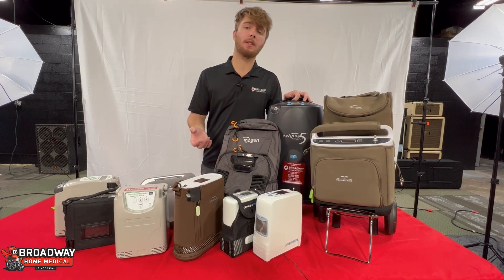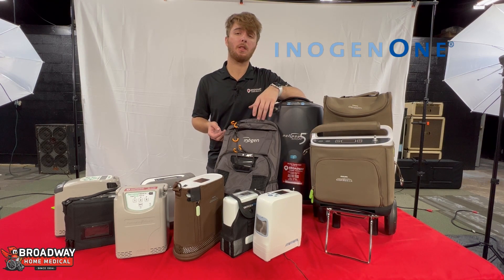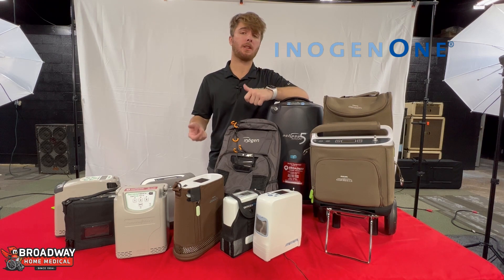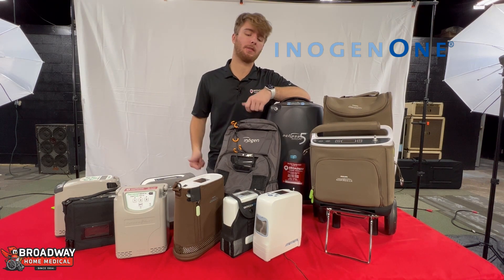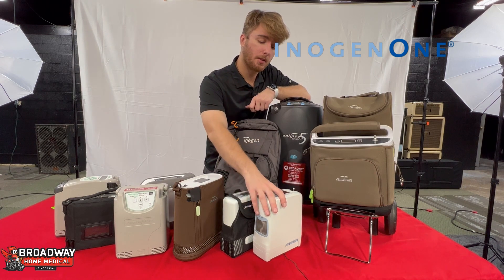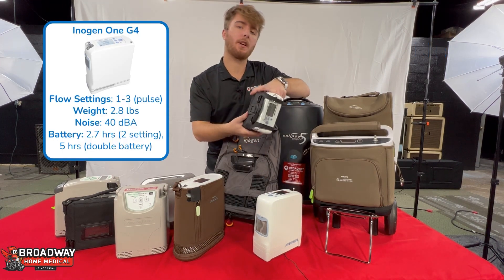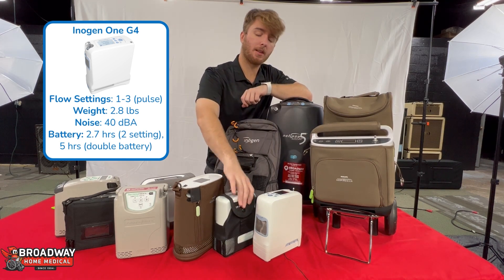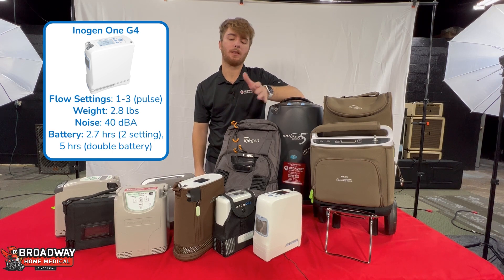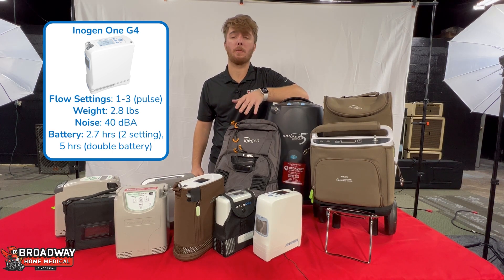To start with, there's the Inogen lineup. You're going to see a lot of advertising for Inogen online — partly because they have a huge marketing budget and partly because they are really good machines. We have the Inogen G4, which is the smallest, lightest weight POC on the market. It goes up to a three setting. The downside with such a small machine is it's only going to have a battery life of about two and a half hours on a two setting.